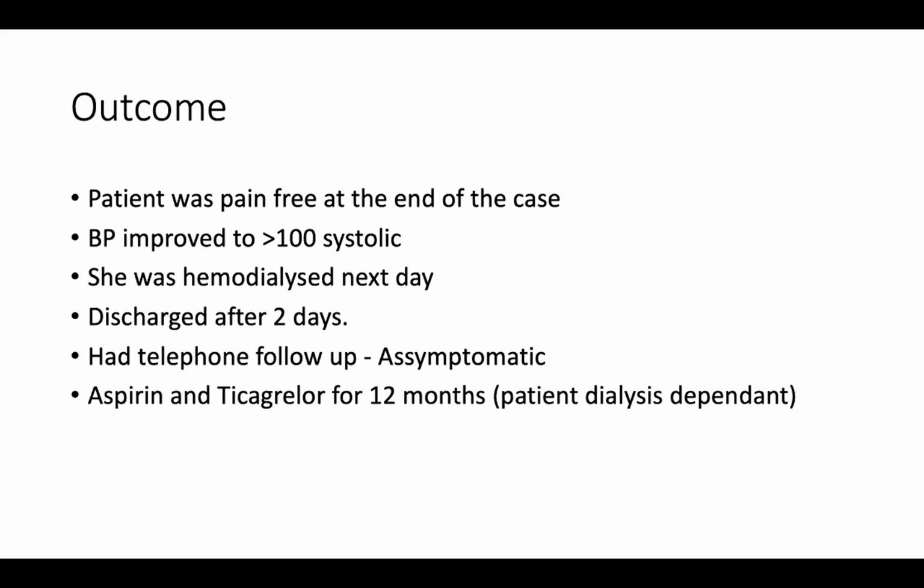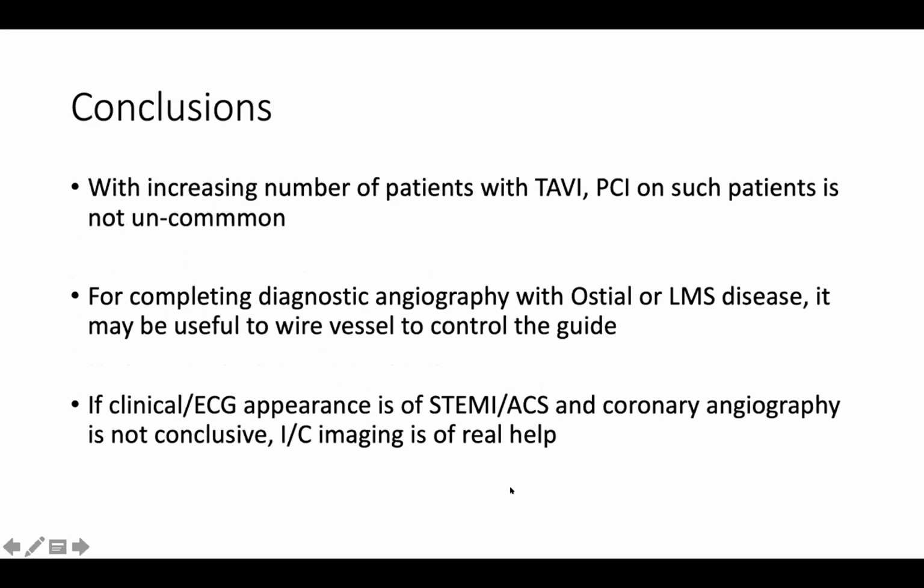Data, I think, for Impella? Jawad, this is your last slide. I think the patient has done well. People may have read it, but then just conclusions. Increasing number of patients with TAVI. Now the PCI in such cases will not be uncommon for upcoming trainees.